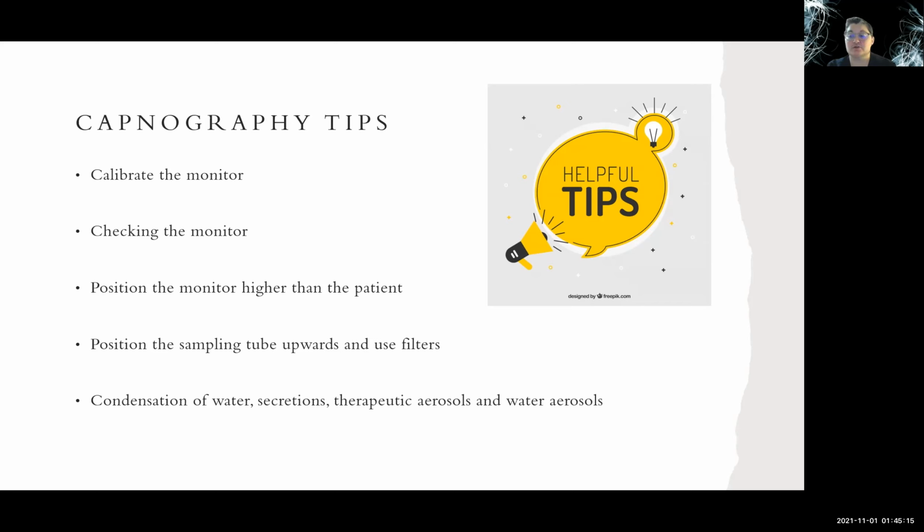We always want to make sure those liquids that enter the main unit of the analyzer are getting trapped in a specific trap unit. If they're not, they can actually cause corrosion and residue, which then can make the analyzer go bad.